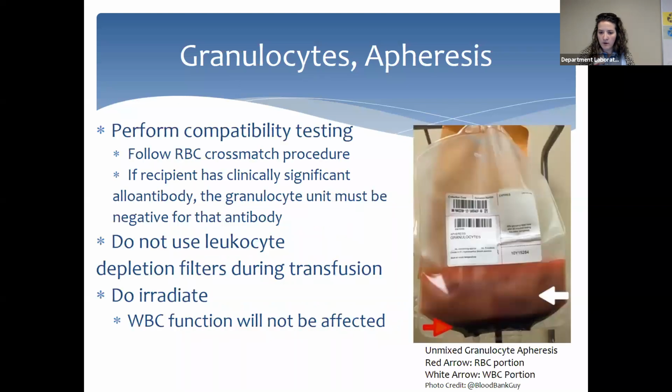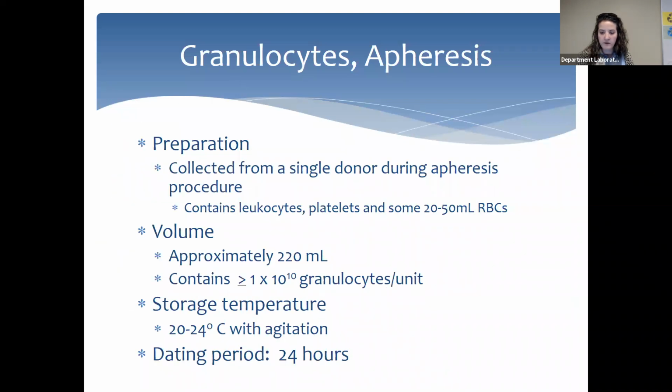All right, expiration time, did we talk about that? All right, so we talked about storage temperature being at room temperature. Look at your dating period. Granulocytes are only good for 24 hours. So granulocytes are not an easy product to come by. It requires a lot of preparation.